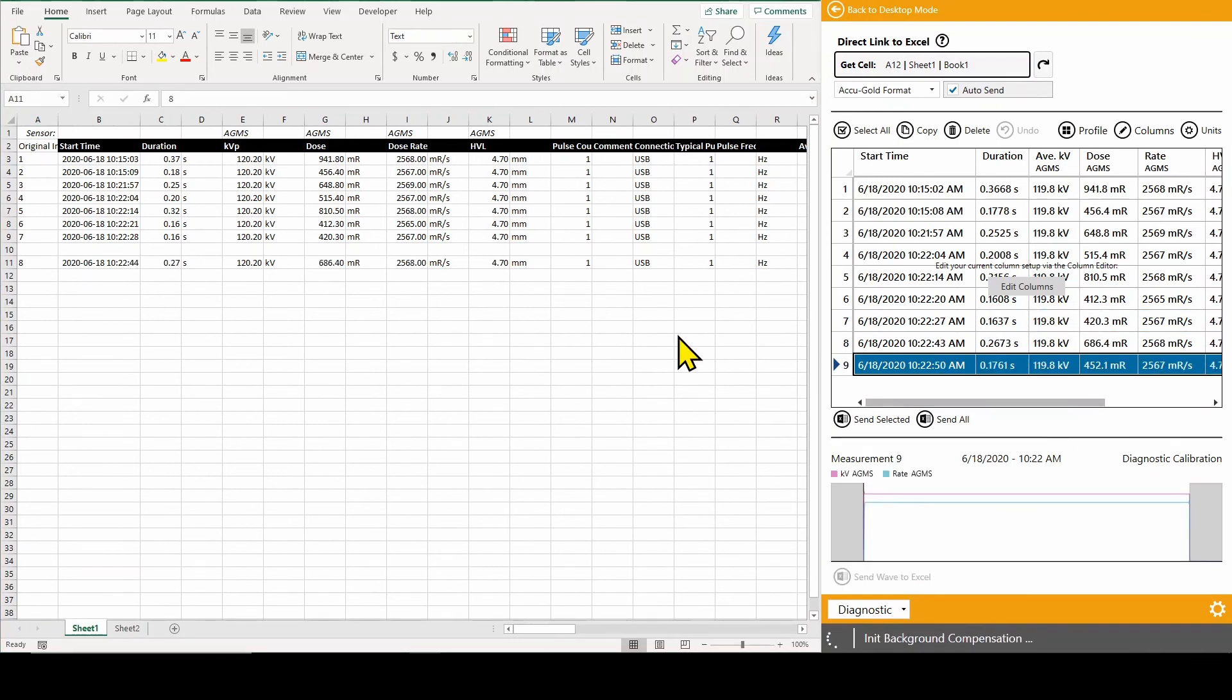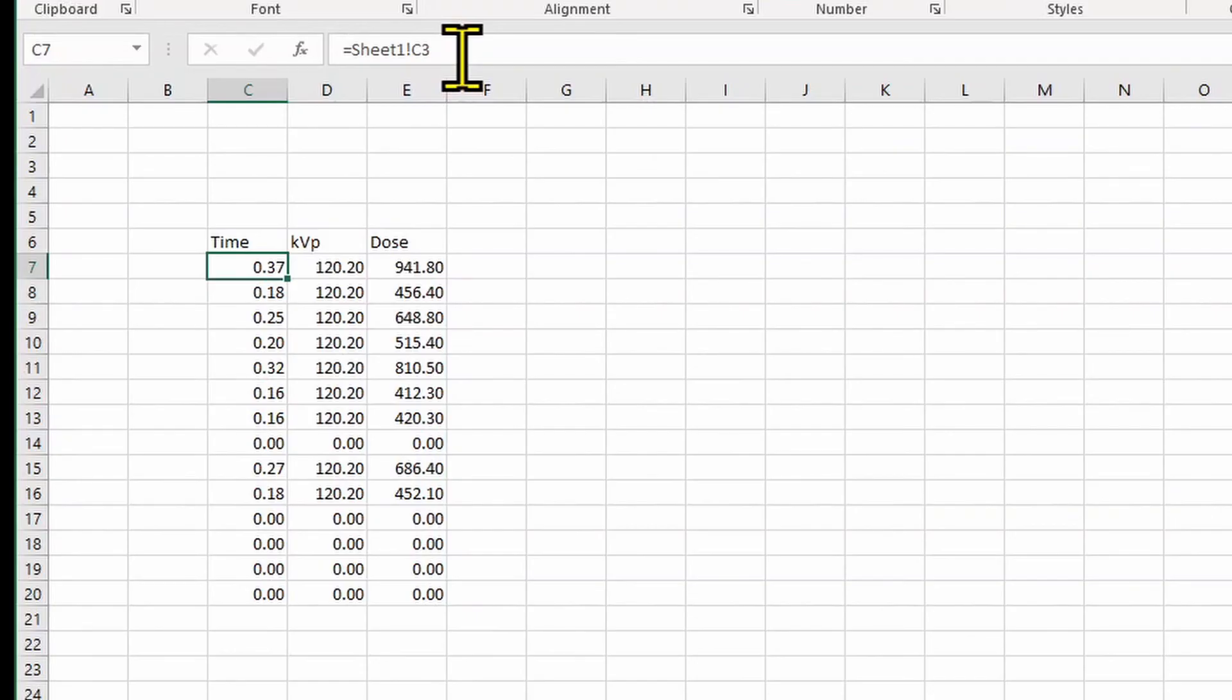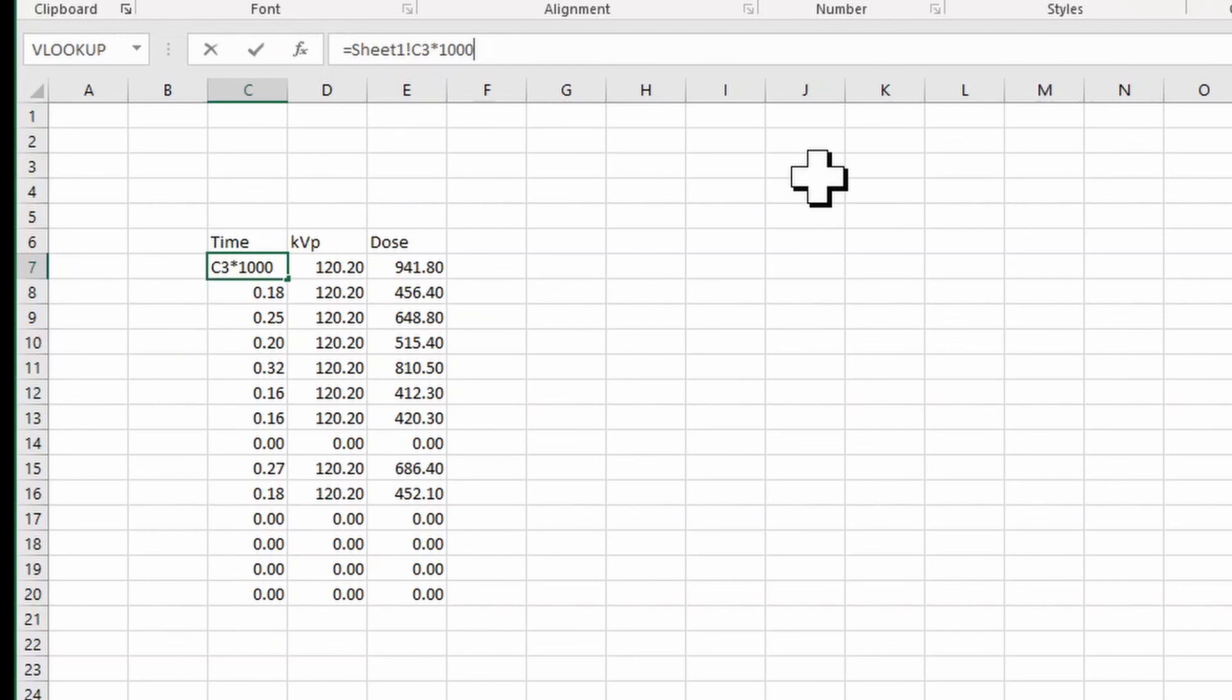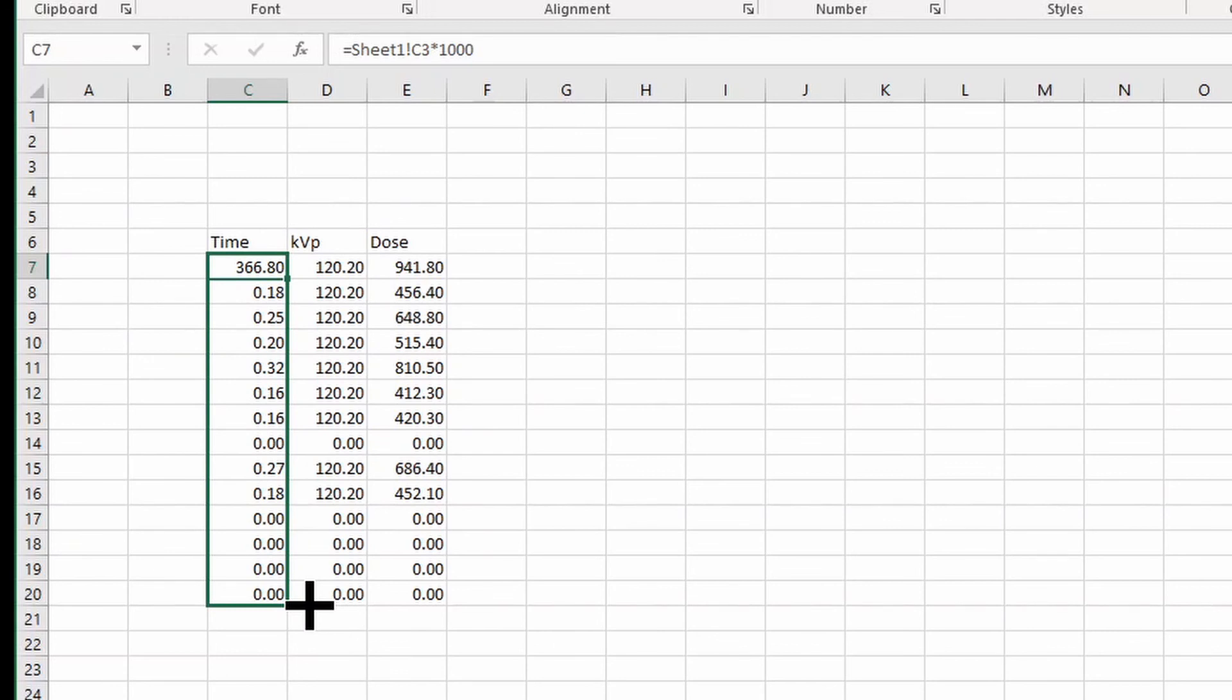By default, the software uses seconds as a time base. If you would like to use milliseconds, you can multiply the time output by 1000 using the formula bar. To do this, select the starting cell, then click on the formula bar and add asterisk 1000, then press enter. We can use the fill handle to apply the multiplier to the following time output cells.